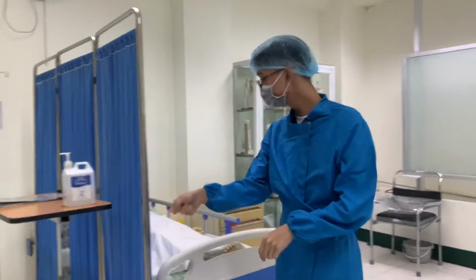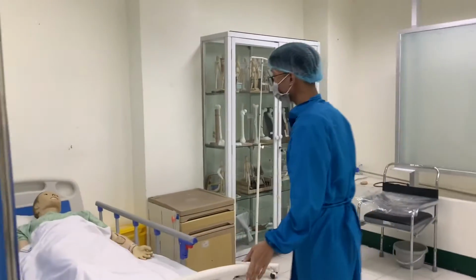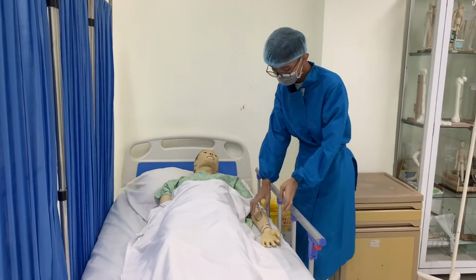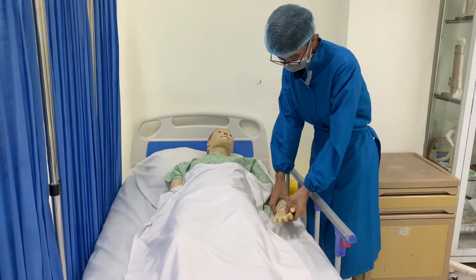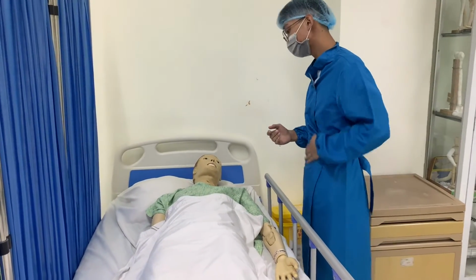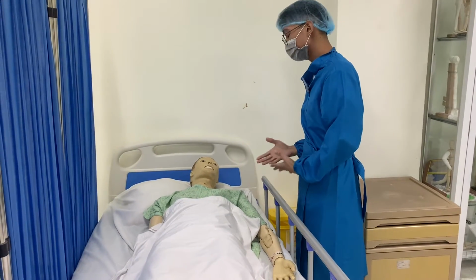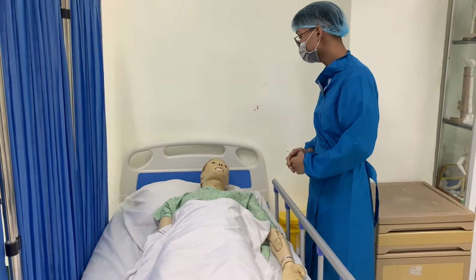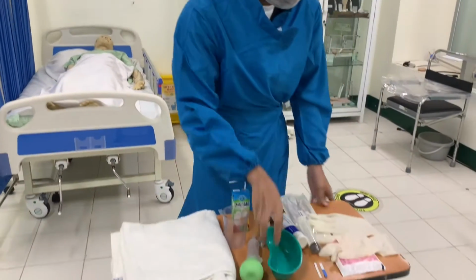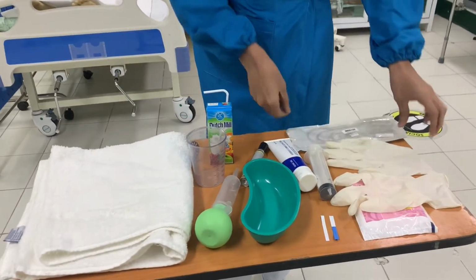Identify the patient. Explain the procedure to the patient and provide a rationale as to why the tube is needed. Discuss the associated discomforts that may be experienced and possible interventions that may allay discomfort. Answer any questions as needed. Gather equipment, including selection of the appropriate NG tube.